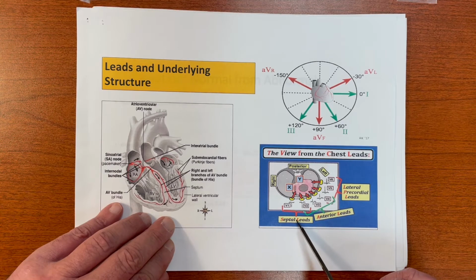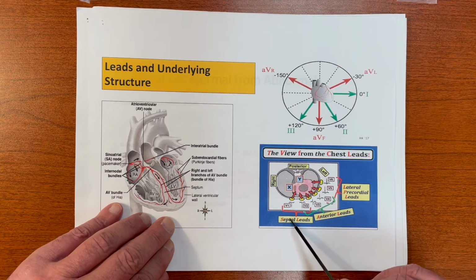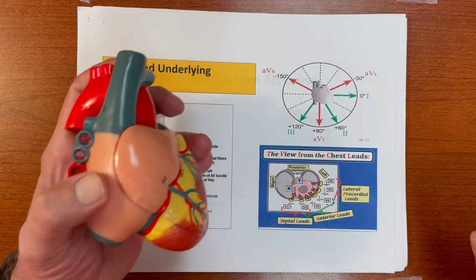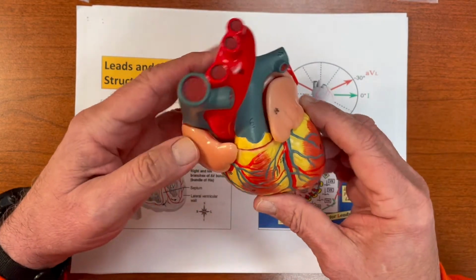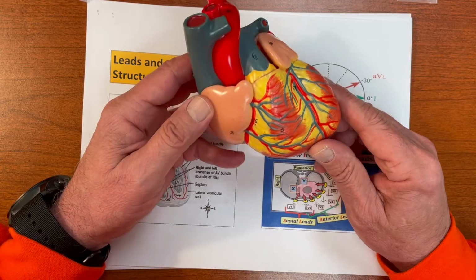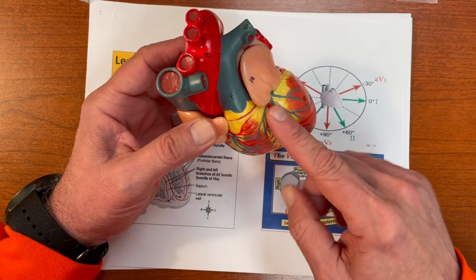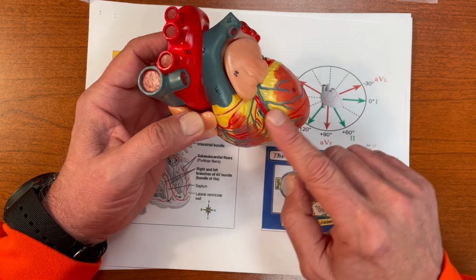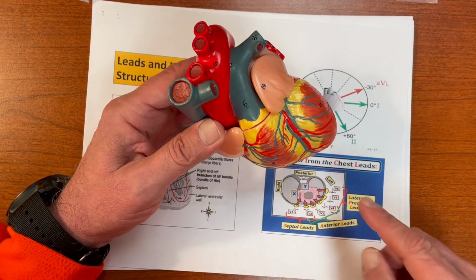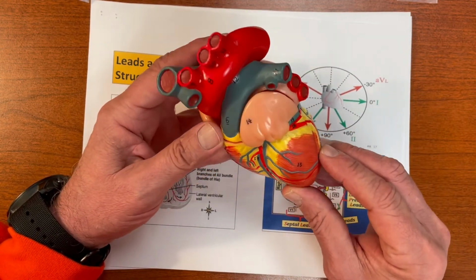Why did we go out of our way to note that? That's because these different areas of myocardium that we are labeling septal, anterior, and lateral are subserved by different coronary arteries. So here we see the left anterior descending artery, for example, going across the anterior surface, giving off branches laterally to the lateral precordial leads. Here we see the right coronary artery feeding the right ventricle, inferior leads like that. So that's the concept, okay?